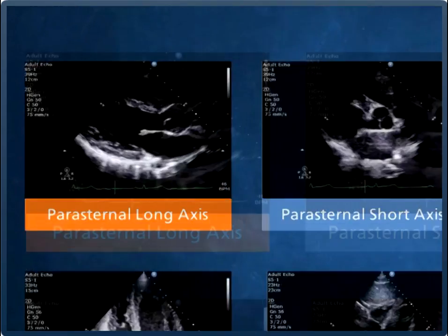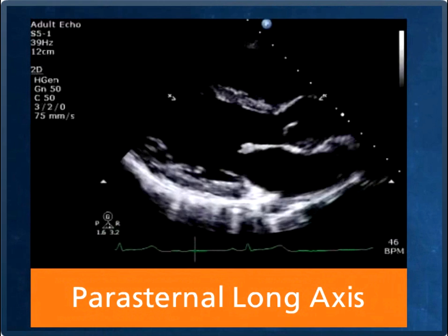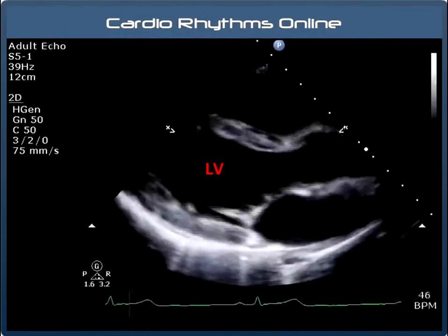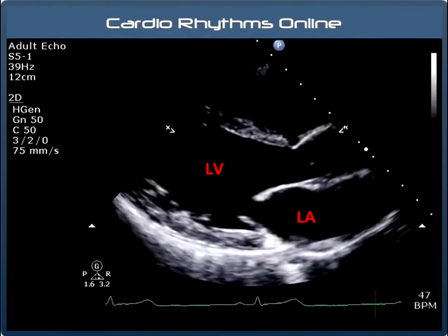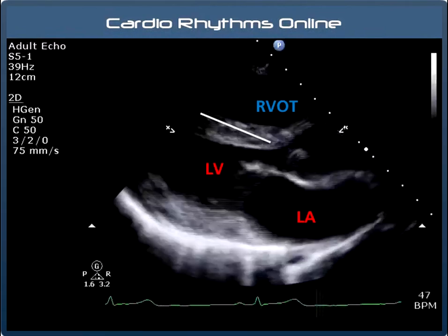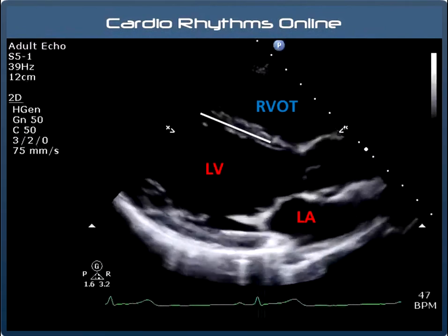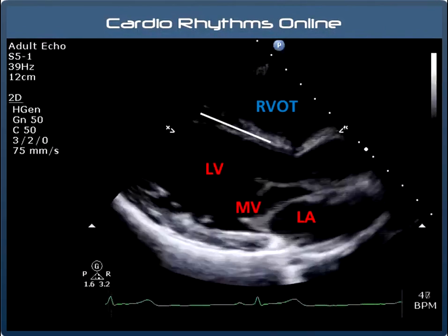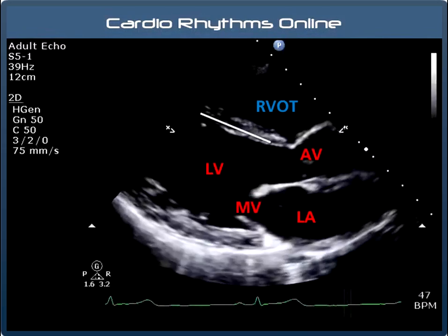If you've never seen an echo before, the parasternal views are probably the hardest to get your head around. The probe is placed around the V2, V3 position and the beam slices through the heart long ways. In this view we can visualise the left ventricle, the left atrium, the right ventricle and the septum. We see only two valves in this view, the mitral valve and the aortic valve.